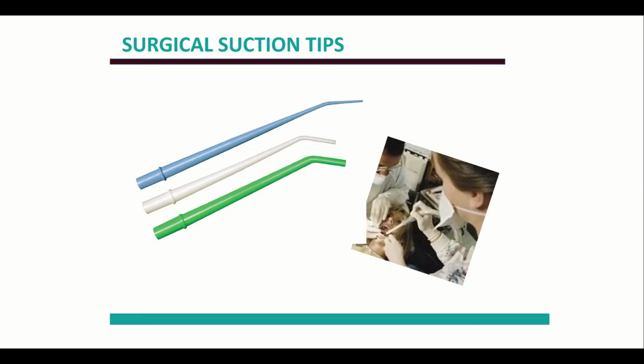All right, and then surgical suction tips. They look just like regular suction tips, but notice they come to a point or a taper at the end. The purpose for that is so that we can actually get this suction tip directly into the socket where we are working. Now you want to be careful with that, because sometimes you don't want to do that, especially on the upper arch in the molar, premolar area, because you might actually suction the lining of the sinus, and we don't want to do that. So follow the doctor's instructions and lead as to where you put these surgical suction tips.